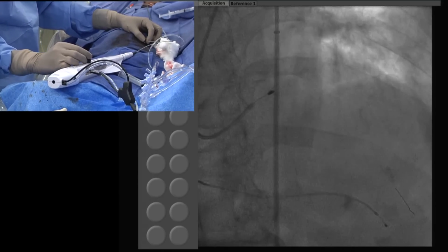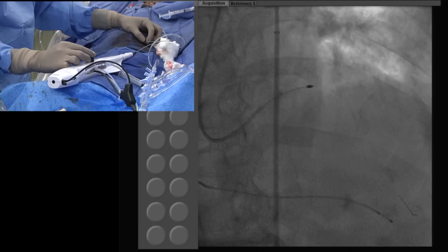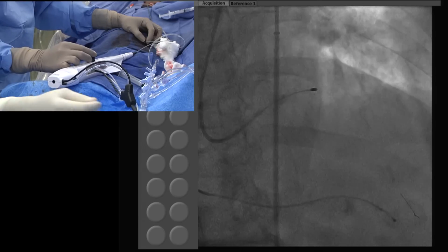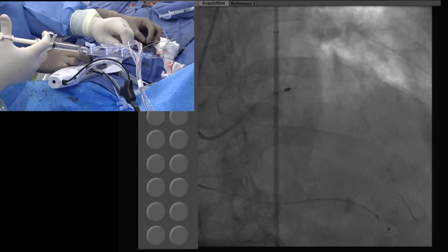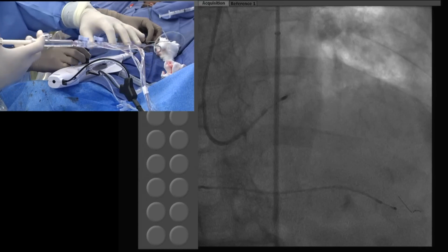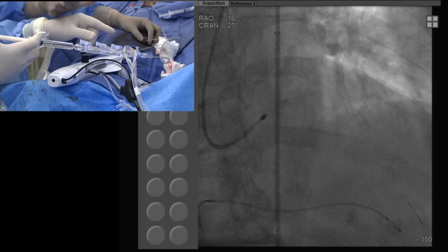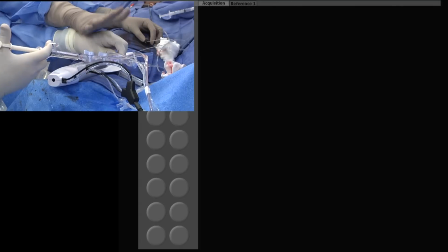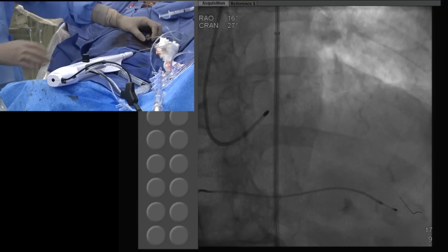What was the cross-sectional area of the left main? The left main was 3.6, so truly narrow. Okay, good. Would you contemplate a larger burr? Don't give that. You have a 6 French guide. Okay, I don't think you need a larger burr.